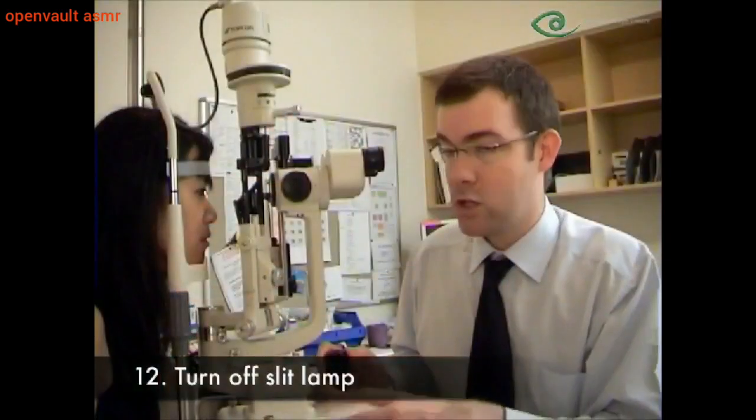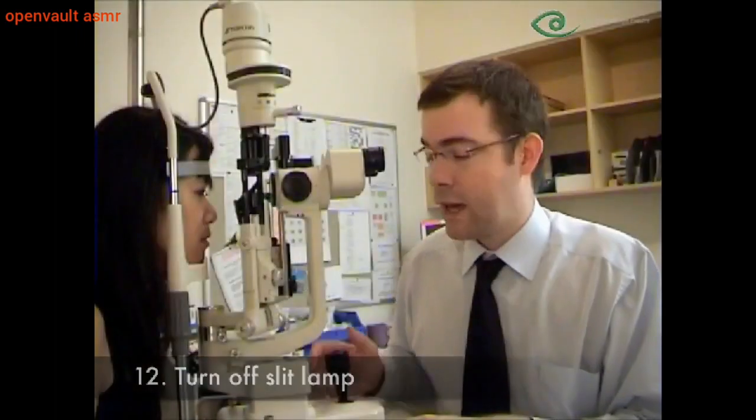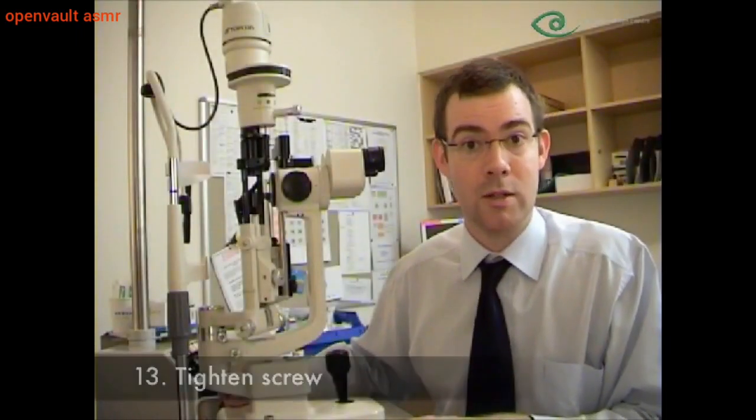At the end of the examination, turn off the power supply to preserve the life of the bulb, and also tighten the screw to prevent the slit lamp moving inadvertently and being damaged.